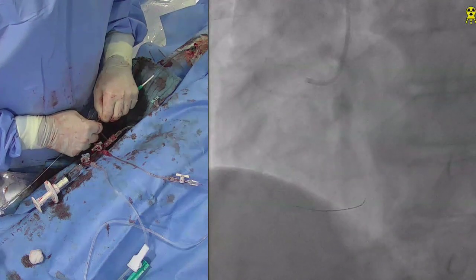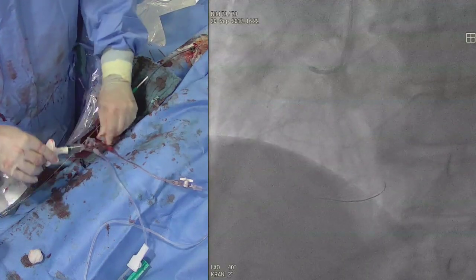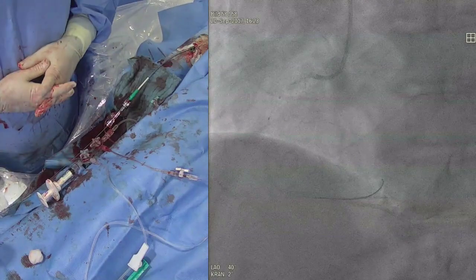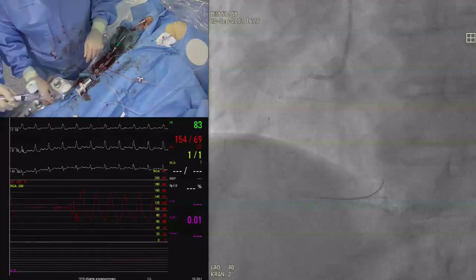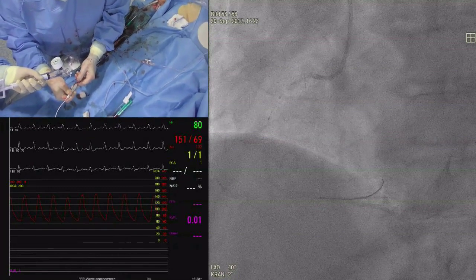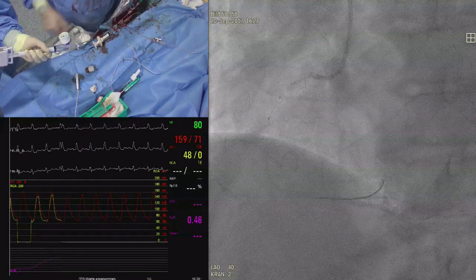And for those who are really crazy about physiology, it's time to reconnect the wire, so to see the coronary wedge pressure during balloon inflation. Do you want to hook the wire up, or should we? For FFR? Yeah, they wanted to watch the physiology as the balloon went up. Well, this is a physiology course, right, Olivier? Yeah. No, I've done that. It's very interesting. As long as you don't use IVUS, we're fine. Okay. We all set? We're set.